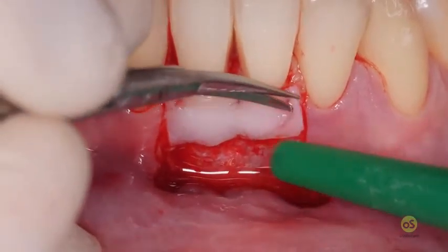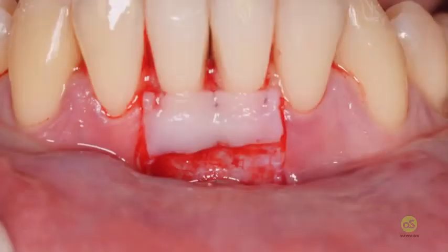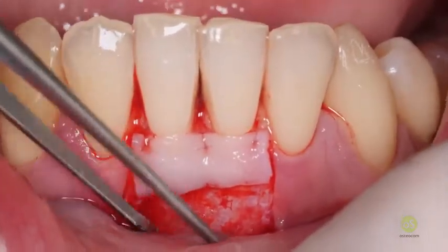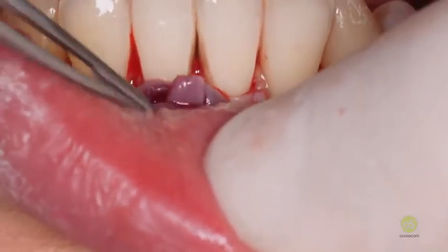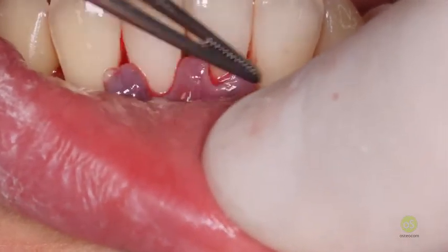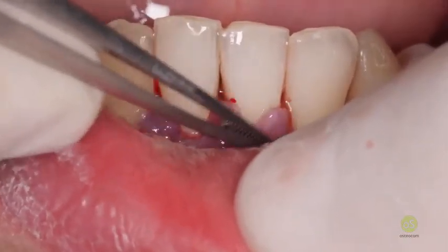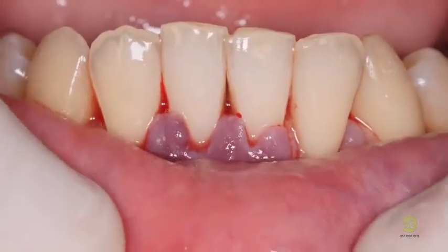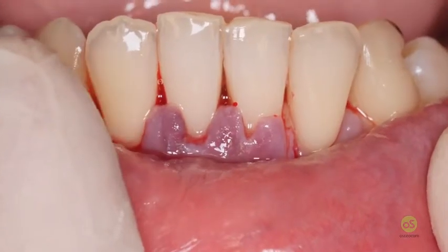Now there is the most important difference between the upper and the lower incisor. We cannot take the papilla in the final position with the tweezers like I did in the upper jaw to close the vertical release incision first. I have to place the papilla in the final position and then close the vertical release incision, and after closing it, I will close the papilla again, because at this time there is still tension, but as you can see, the three papillae are in the final position.